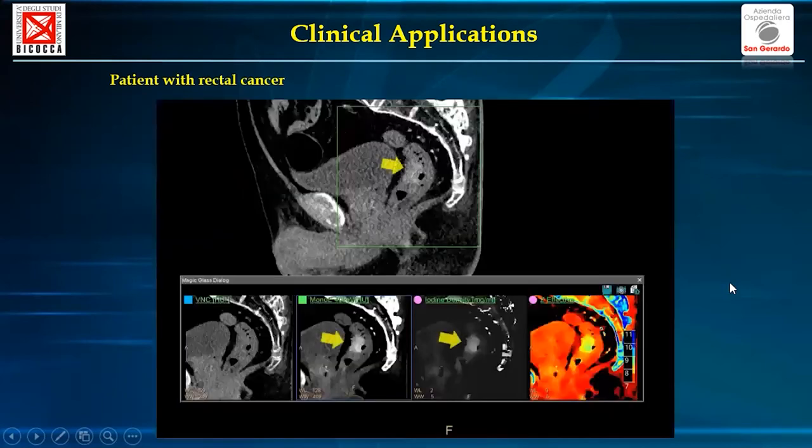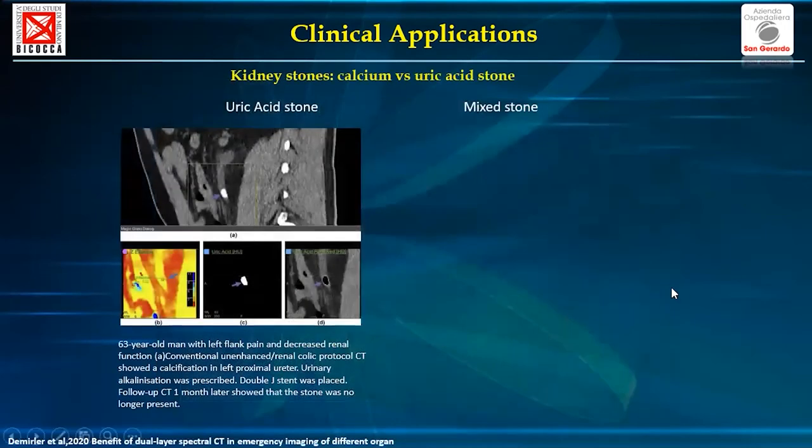But what can we do with CT? Usually, we can reconstruct the images on sagittal, coronal, and axial planes. And so, in one case, we spend only 4 minutes to make an overall evaluation of the body, while with MR we need more than 20 minutes for a correct protocol. Therefore, also with CT now, we are able to correctly stage the lesion and recognize the different structures or the enhancing tumor. And let's move to another really important application in everyday clinical practice, the characterization of kidney stones.